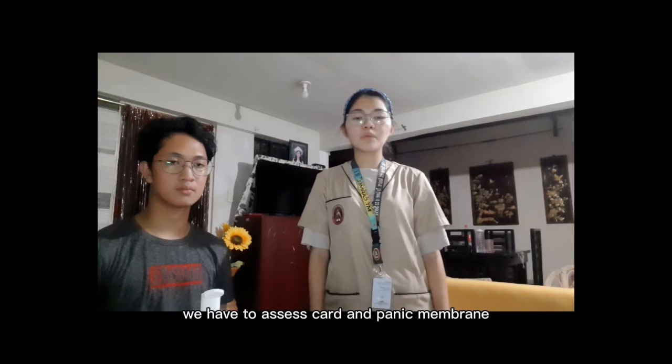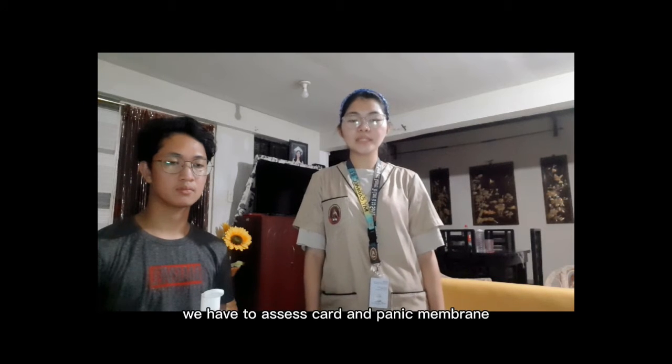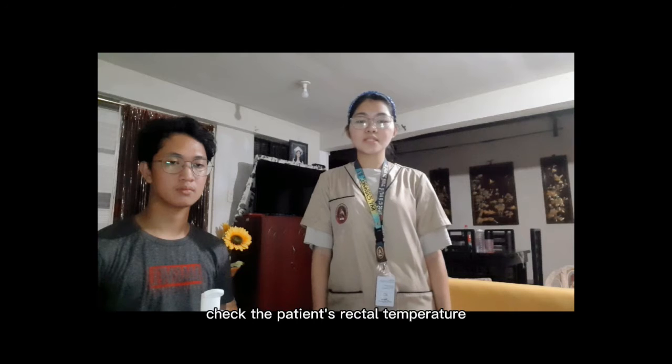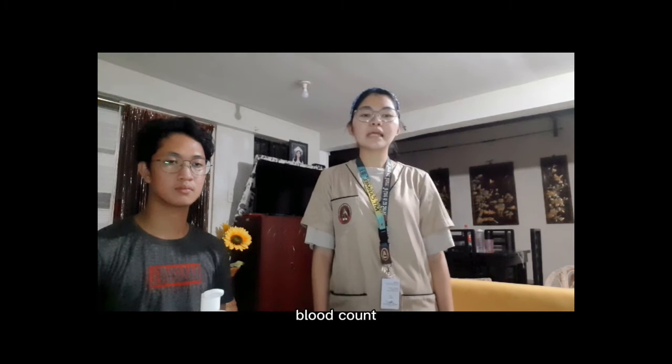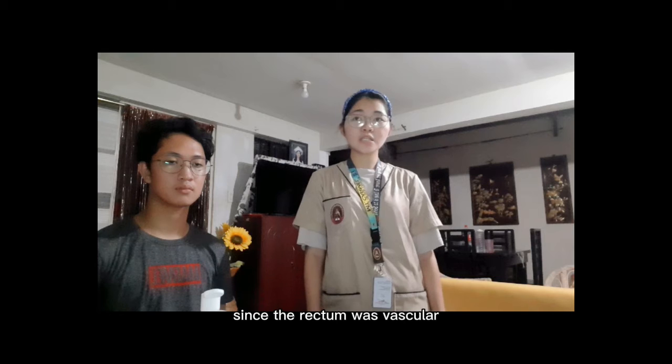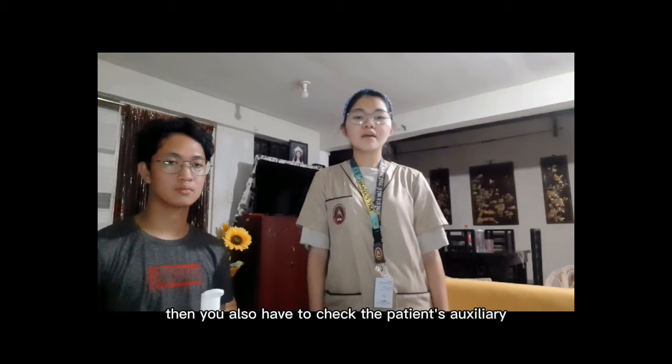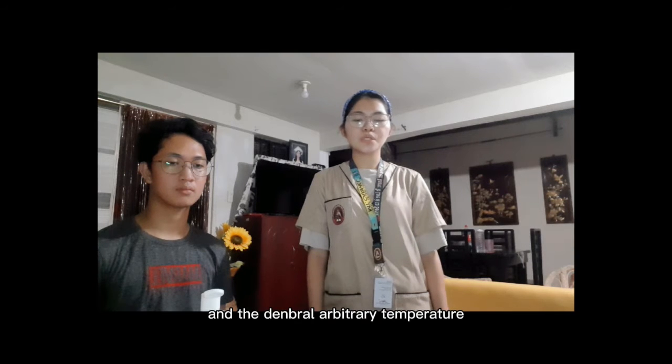So for assessment, we have to assess core tympanic membrane, check the patient's cognitive functioning, check the patient's rectal temperature, also check the most recent platelet count since the rectum is vascular and the thermometer may cause rectal bleeding. Then we also have to check the patient's axillary temperature and the temporal artery temperature.